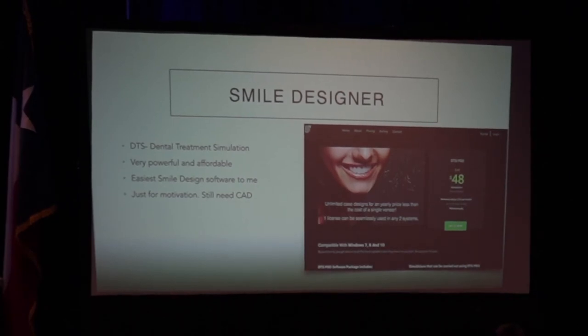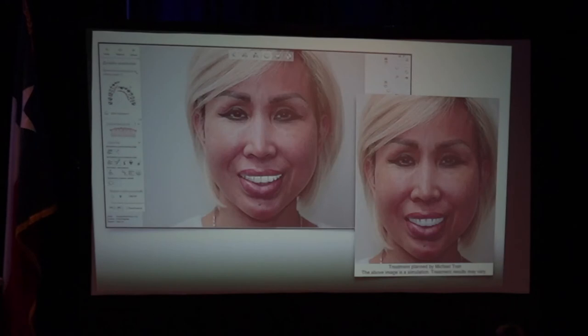My assistants will do a digital design process. If we take the photos and somebody says they're interested in it, they can design this super, super quick. On the left is exocad design. That's what my designer did. And on the right is what our assistants did in like 3 to 5 minutes.